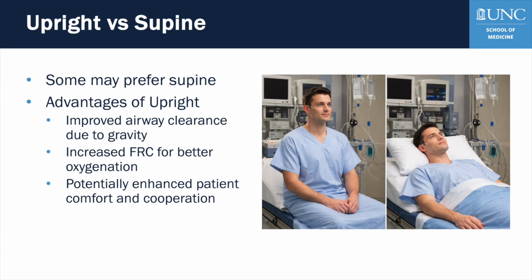Although some providers may choose supine, for an awake fiber optic intubation, we generally prefer the patient sitting upright. The upright position improves airway clearance through gravity, increases functional residual capacity for better oxygenation, and often improves patient comfort and cooperation. These advantages can make the procedure smoother and safer, especially in patients with limited respiratory reserve.